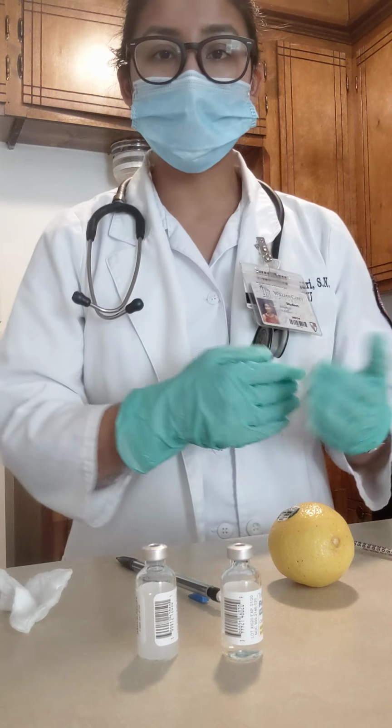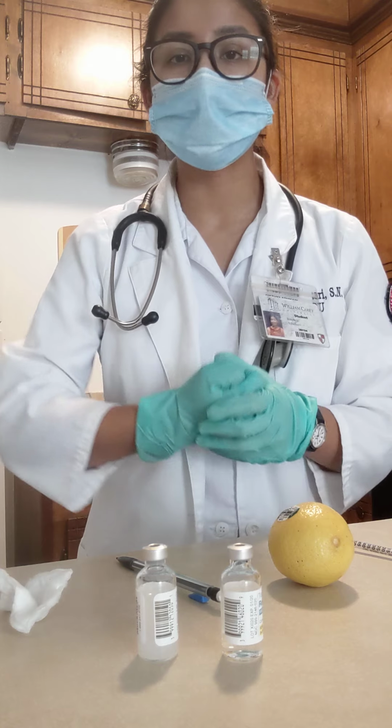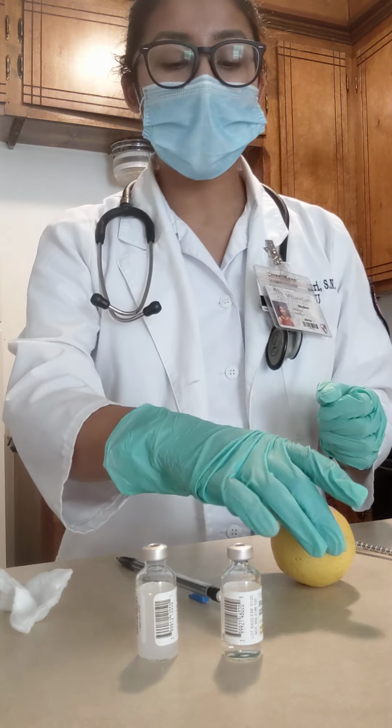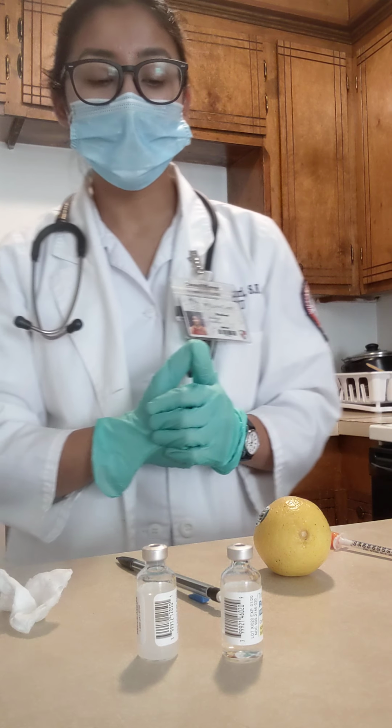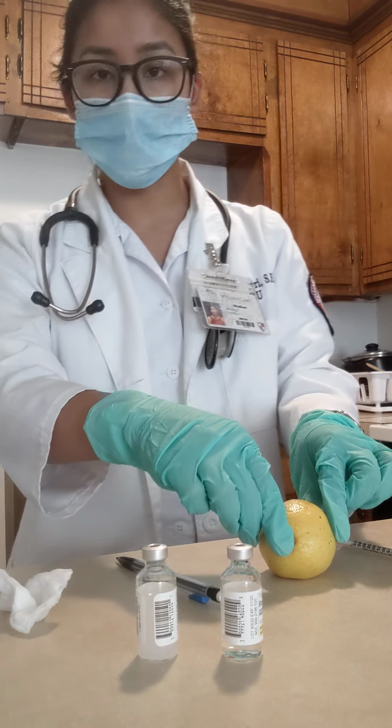The patient states that he wants to eat in 30 minutes, and the previous injection site for the patient was the upper outer left arm, and today we are going to administer insulin in his abdomen. The skin on his abdomen looks intact. There is no redness or swelling.